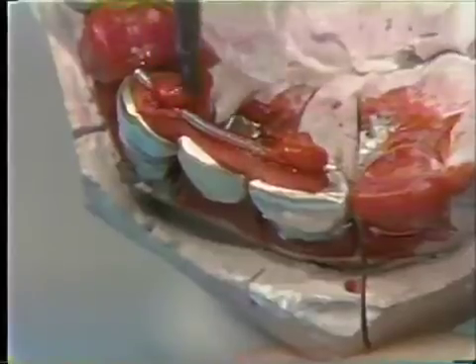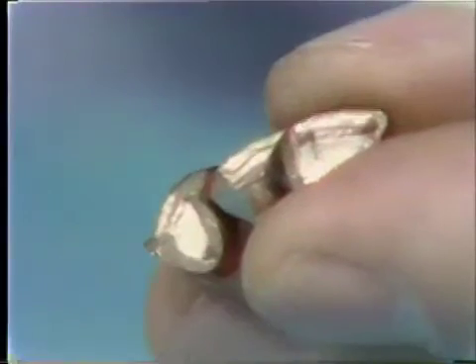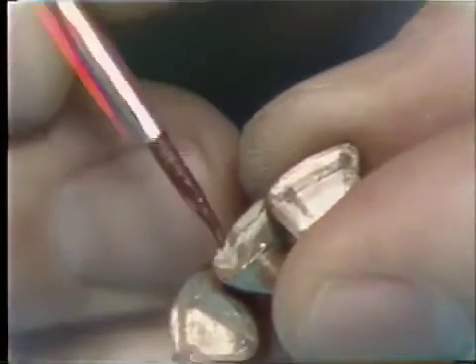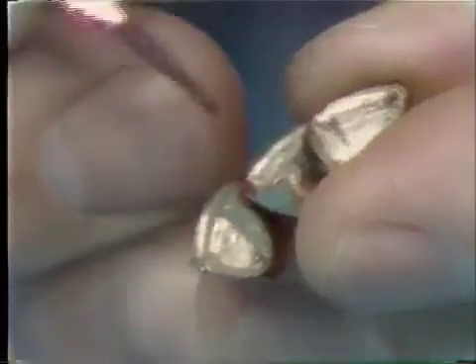More Duralay is added on top of the paper clip to secure it firmly to the soldering relationship. Antiflux is applied to the internal portions of the castings — only a minimal amount need be applied. The purpose of this is to keep the solder from flowing onto the internal surfaces of these castings.